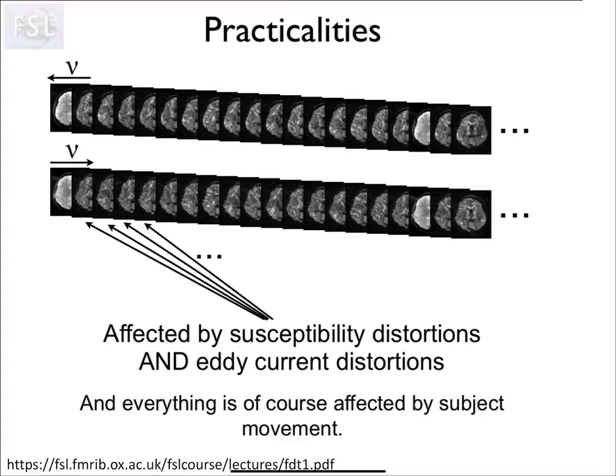Yeah, but it's certainly something. There are, for example, lots of cases of U fibers, right, which turn on themselves, and those can be very challenging for most methods. So there are people who are doing very high resolution and also going to higher B values, really focusing on gray matter and other more challenging areas. They are looking at things like that. But for these standard protocols and the standard analysis, it's not really quite there yet. Okay. Anything else? Okay. Yes.